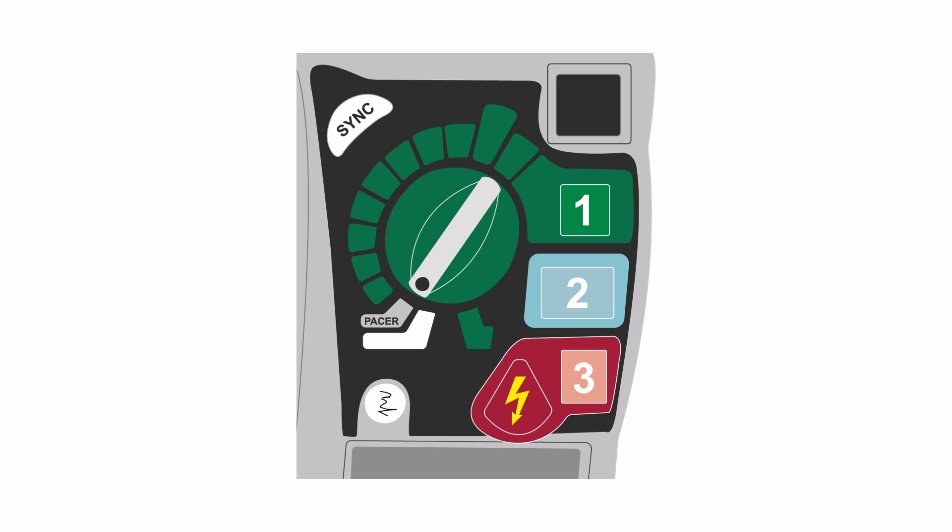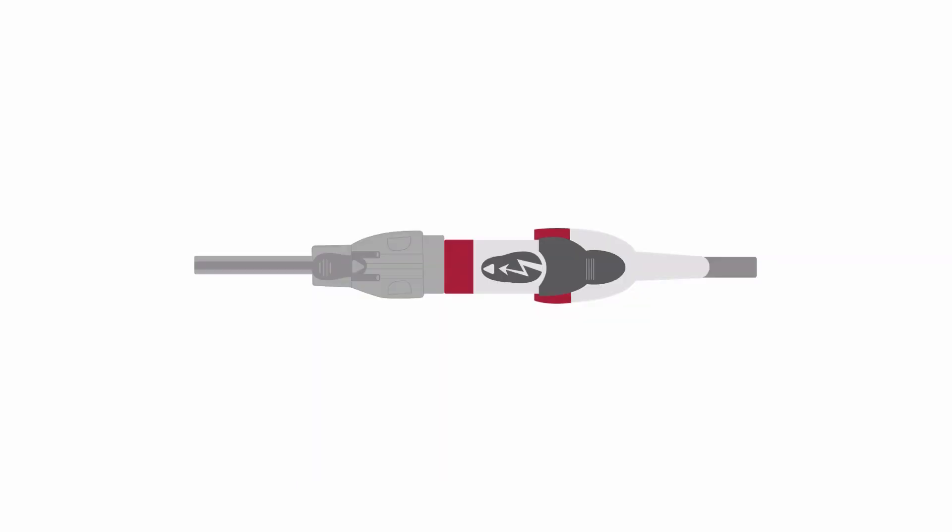The first step is to turn the machine to pacer mode. You also have to connect the monitor leads and the pads to the pacer.